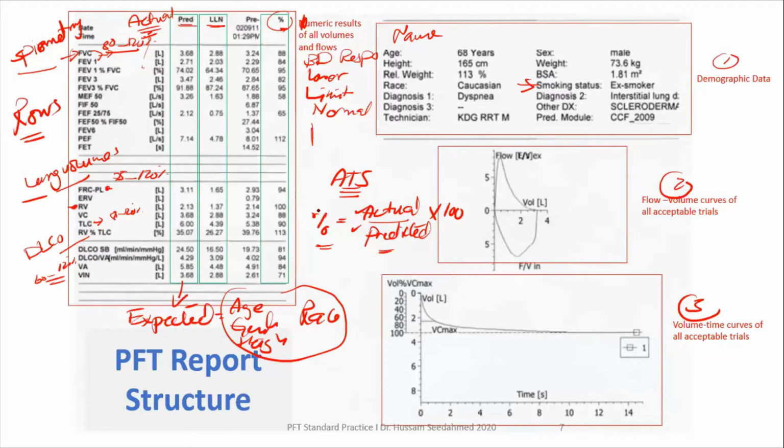That is why when we use the percent predicted, we can do without the predicted and the actual. For example, if my patient has an FVC that is 50% predicted, it means, if his predicted is 4, then 50% means he got 2 liters FVC. So I don't need to know the measured or the predicted value. It just gave me an idea. That's why mostly you look at the percent predicted. So I hope it is quite clear.